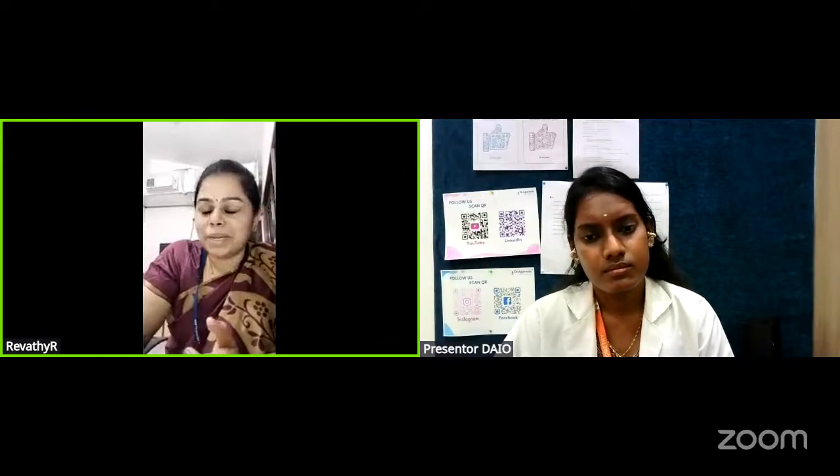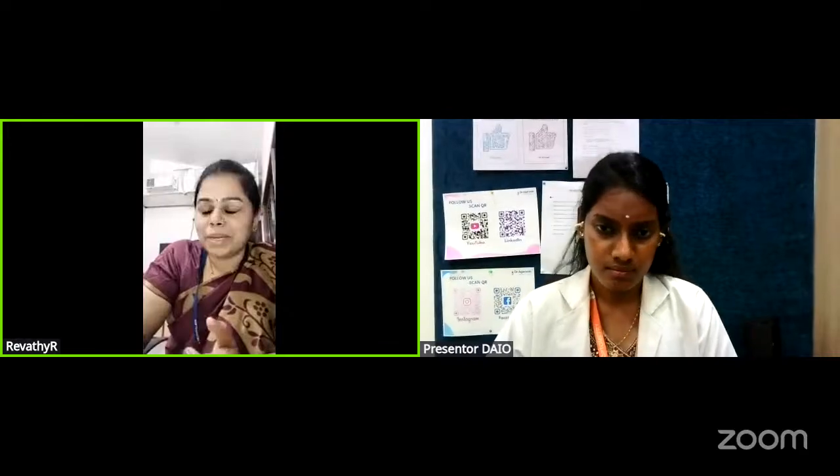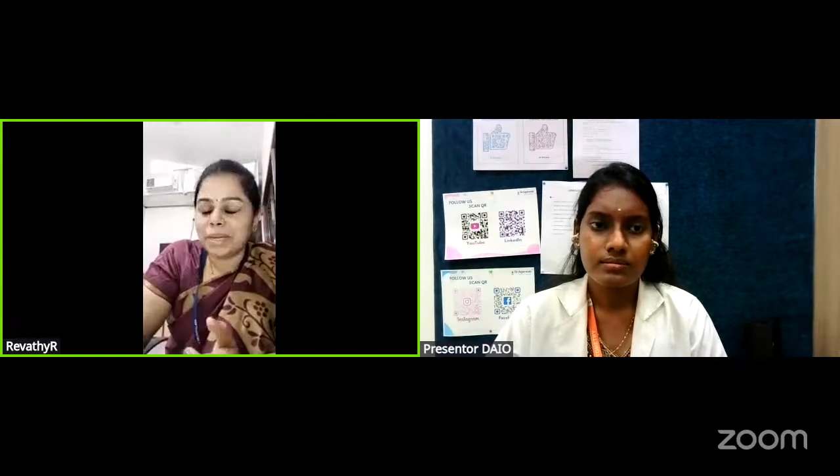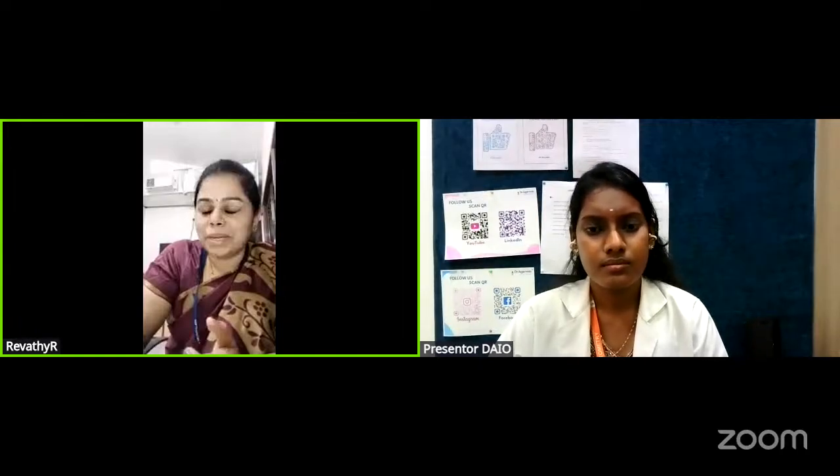Same thing with manual keratometry also. The quality of the mires has something to tell us, like how good the cornea is, how smooth the cornea is, and what the tear film quality is. Even before you make them sit at the slit lamp, you can tell if the patient has a low TBUT. Tear breakup time being lesser, you can easily tell that. We actually perform something called non-invasive TBUT using keratometry. How is it performed?